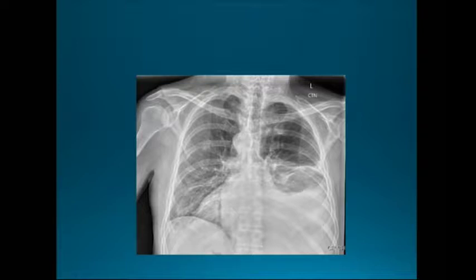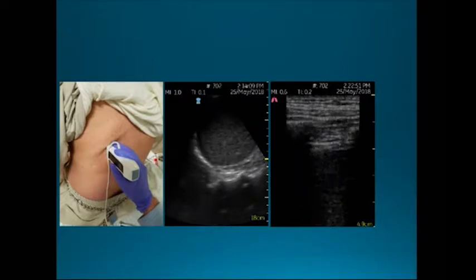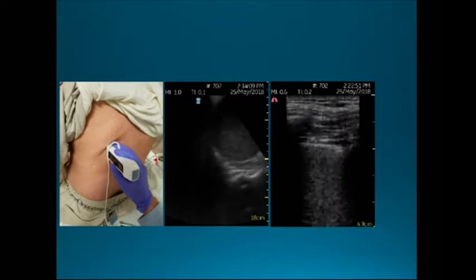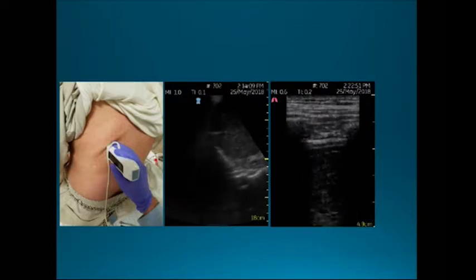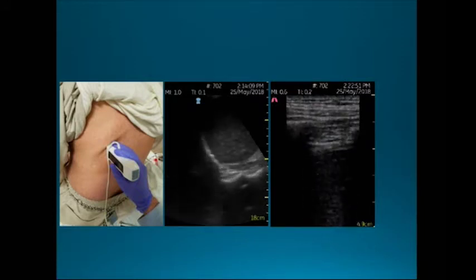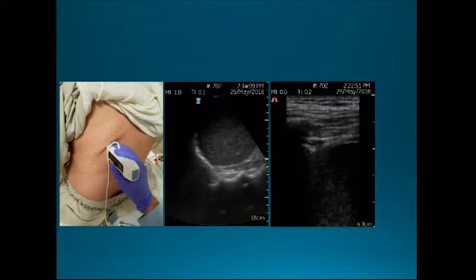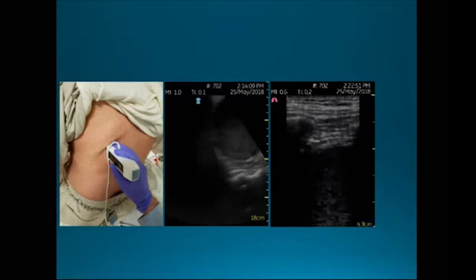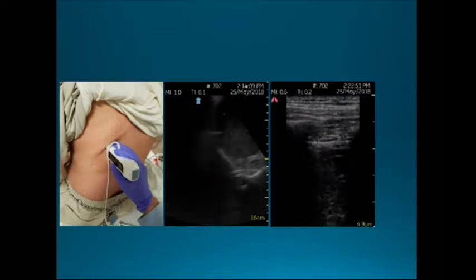But when we actually set things up, this is us using an ultrasound probe, focusing on the patient's left-hand side. What we see here is his spleen, and this is his diaphragm. When he takes a deep breath in, we see this artifact coming down here, and what we don't see is a bunch of black. We see this artifact pattern, and this spine here is eliminated as he breathes in. This artifact pattern lets me know with 100% certainty he does not have a left-sided pleural effusion.